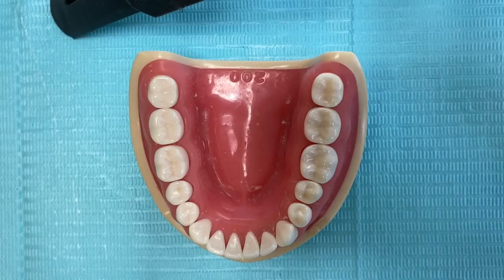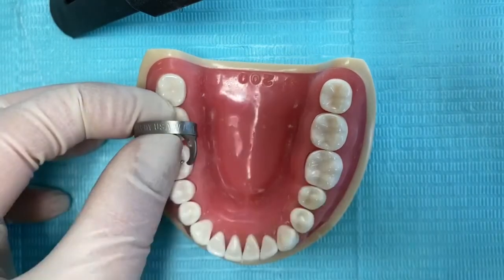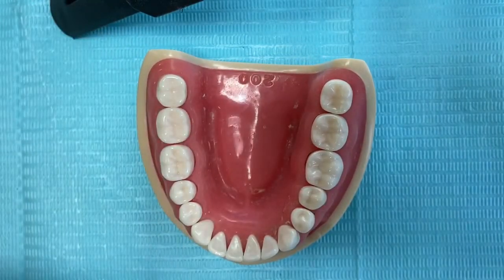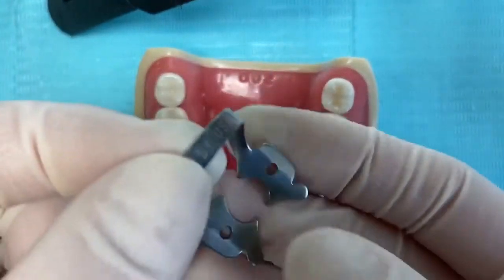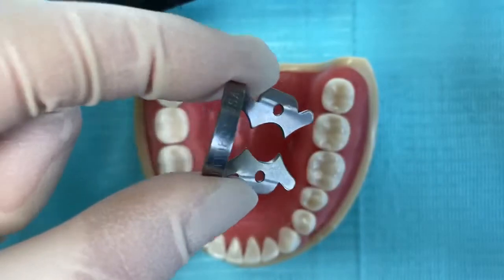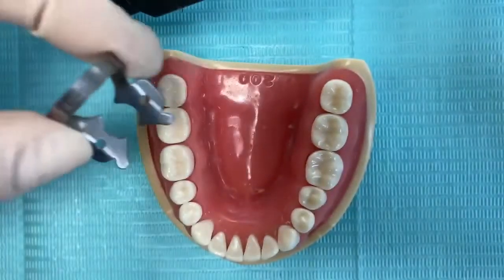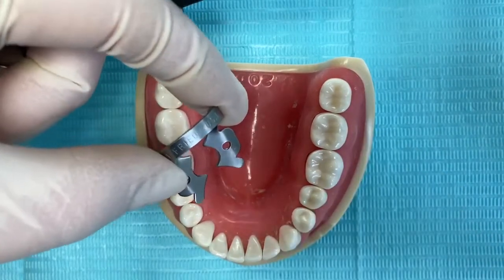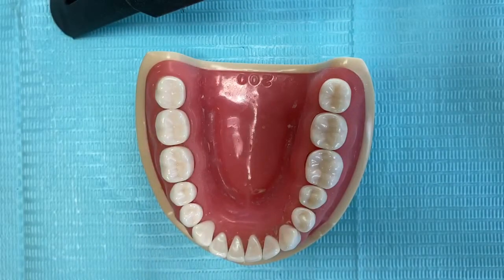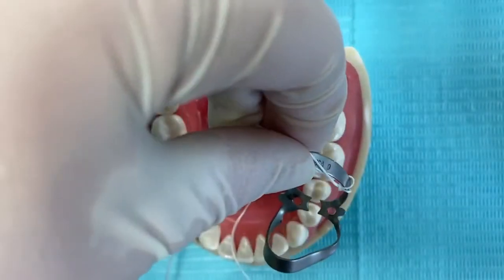There are three ways to place a clamp with the rubber dam. First, you can place a clamp followed by the rubber dam, or you can place the clamp with the rubber dam simultaneously — we use this mostly with winged clamps. Winged clamps help with more retraction, but it's difficult to place the rubber dam over them once inside, so we place them together. There is a third way: placing the clamp after placement of the rubber dam, which we will explain later.